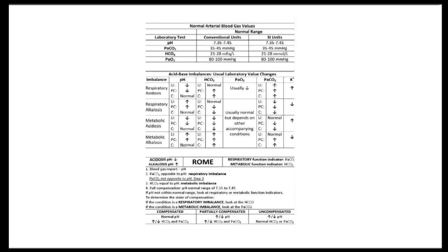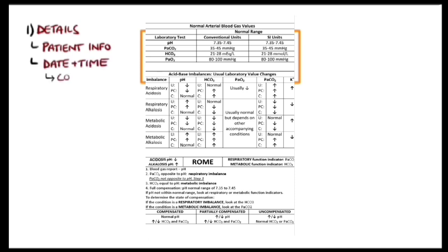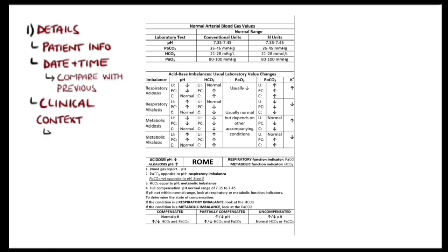You should also consider the ABG in the context of the clinical state of the patient. Linked to this, the gas should also indicate how much oxygen the patient was using when the sample was taken, which varies between different flow rates and different oxygen delivery devices. I then look at the partial pressures of oxygen and carbon dioxide. This is effectively a measure of the amount of oxygen and carbon dioxide dissolved in the blood.